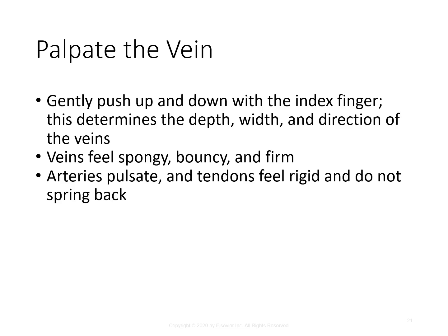You also do not want one that is pulsating because that could be an artery. Tendons can look like veins as well, but they are rigid and they don't spring back like a vein will. If you have difficulty locating the vein, you can increase the circulation by gentle massage of the arm where that vein is located, or by asking the patient to make a fist.